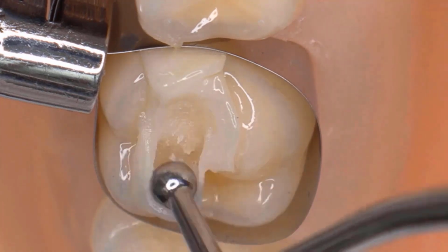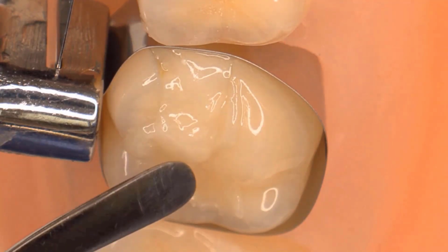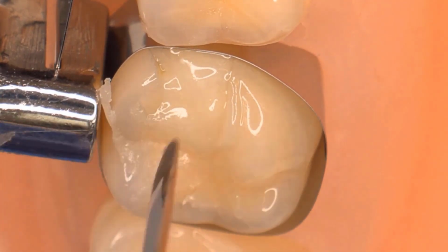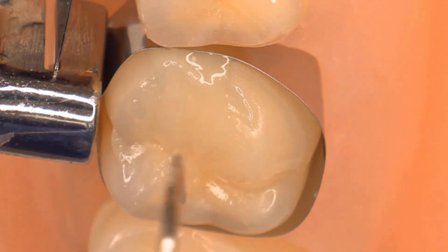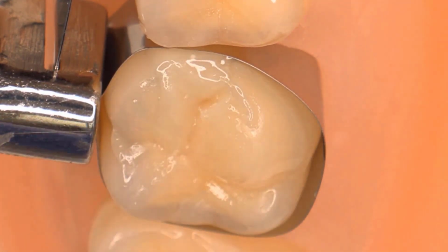Gently pack and condense with an instrument like a ball burnisher. Remove the excess with a flat plastic instrument or a spatula. You can adapt the material with an instrument of your choice. Here being used is a posterior composite cone-shaped burnishing instrument. A shepherd hook dental explorer is useful to recreate the fissures.